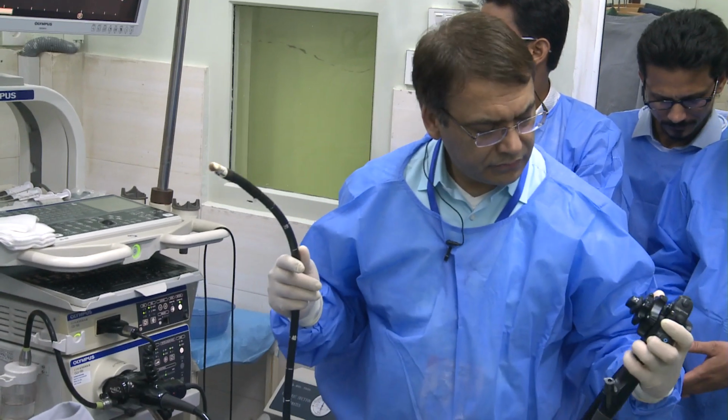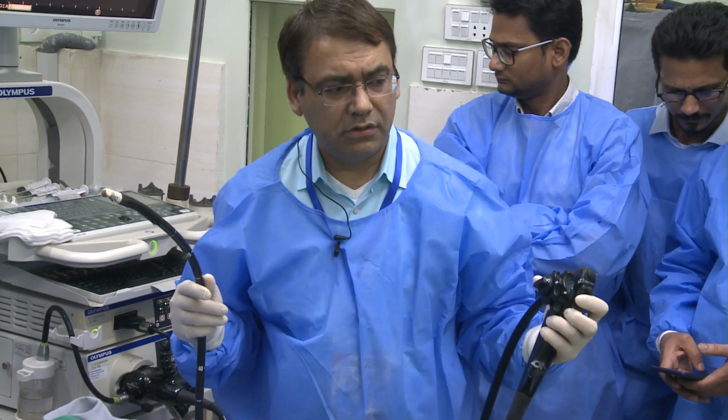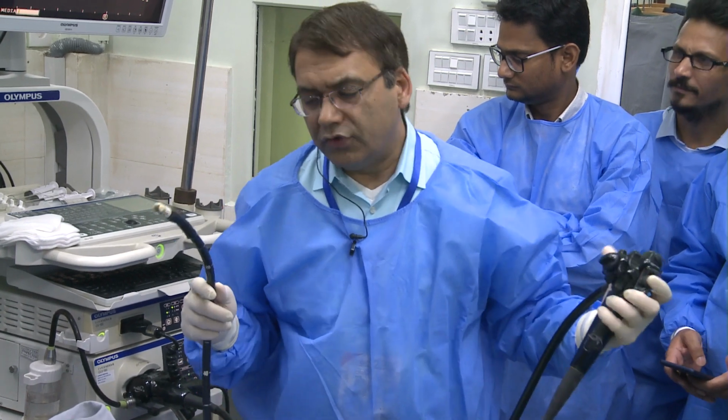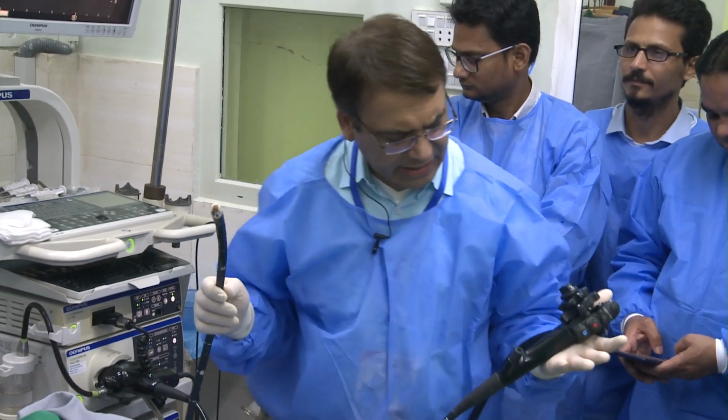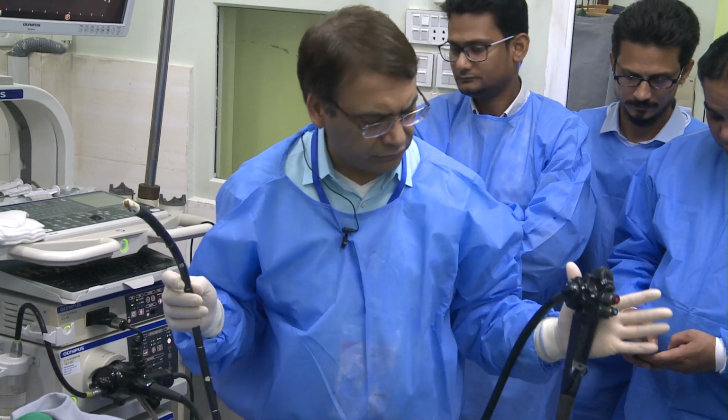that helps me achieve that. Khalid, Mustafa and I do that. Okay. Ghiyas and Farouk, Farouk doesn't routinely use the balloon on it, and Ghiyas doesn't. Okay. So either way is fine. And with linear, you can achieve the goal without the balloon as well.